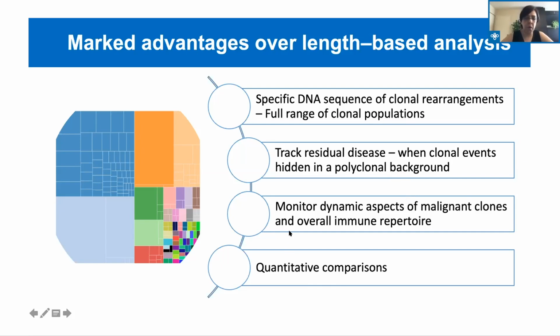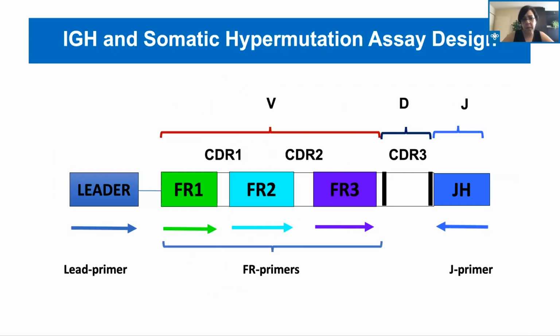So if you were to plot the different sequences that you would have on a malignancy, you could see that you have different types of clones, for example, and this is one of the analyses that we usually do, where we have one clone or several different clones with different proportions, as you can see in this specific plot.